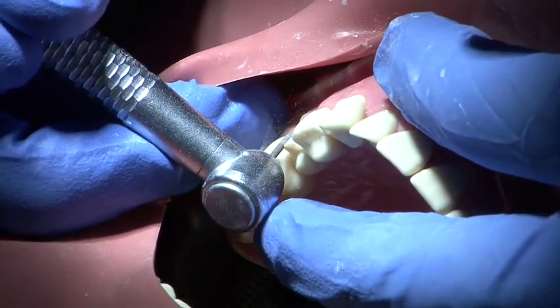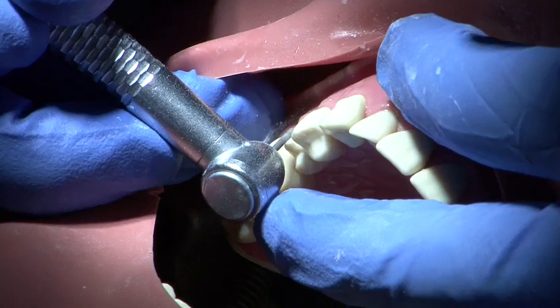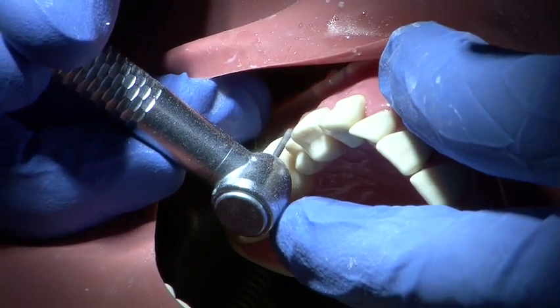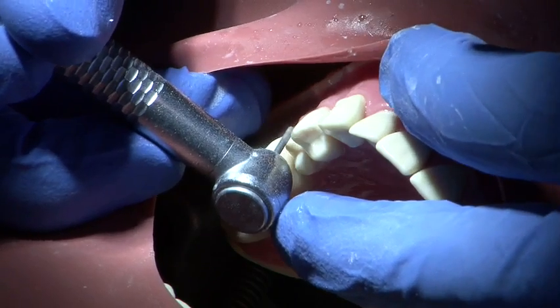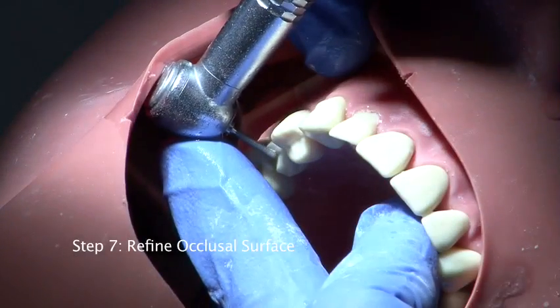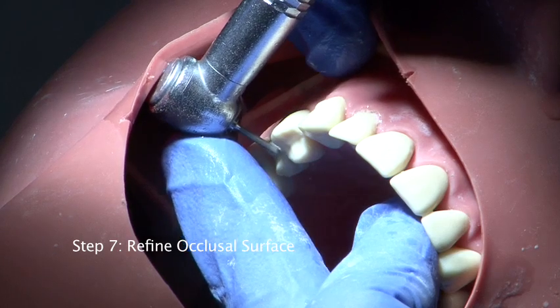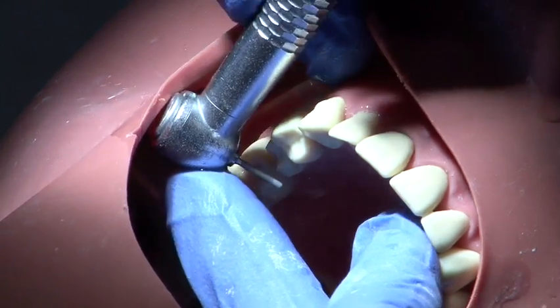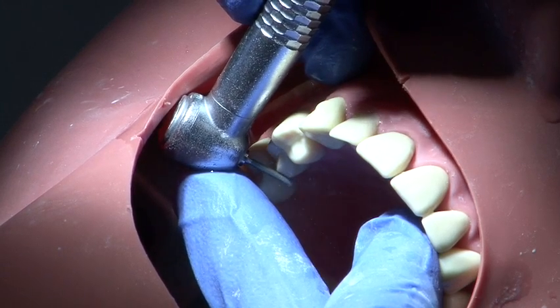The buccal surface is prepared in two planes to follow the natural contour of the tooth and ensure even reduction. The occlusal surface is then refined to ensure that there is adequate reduction on the buccal surface for ceramic and on the functional cusp bevel.